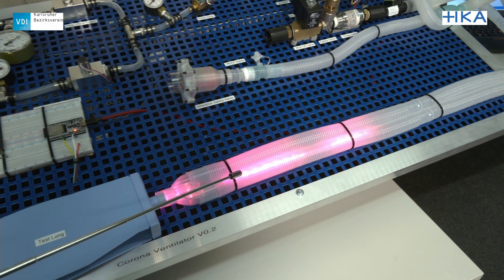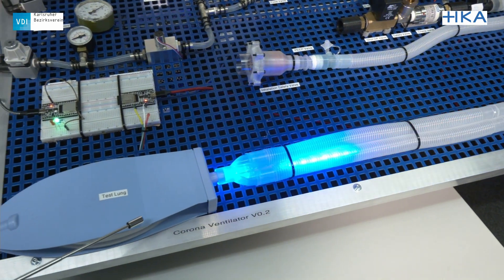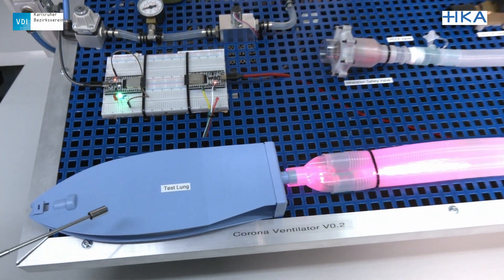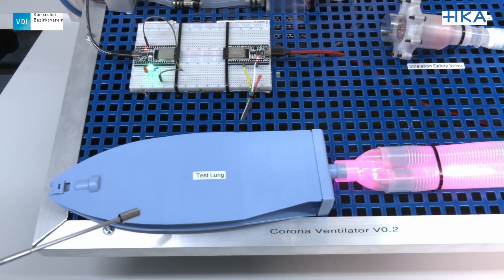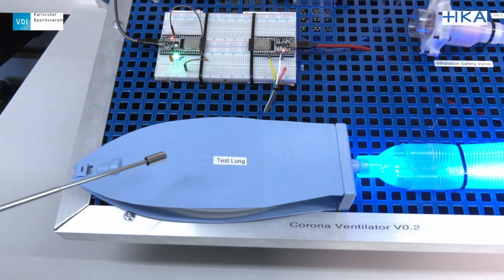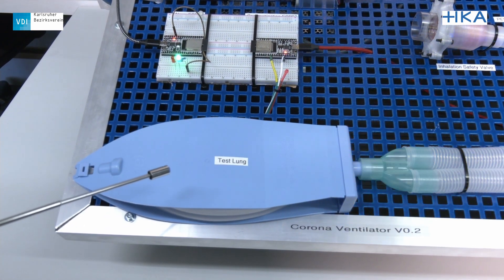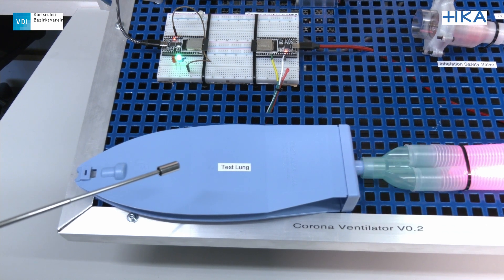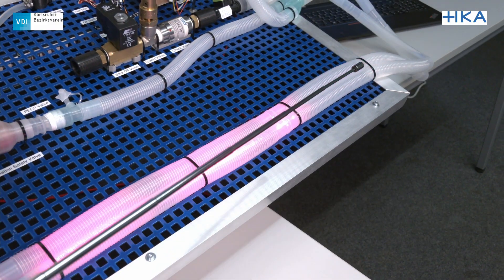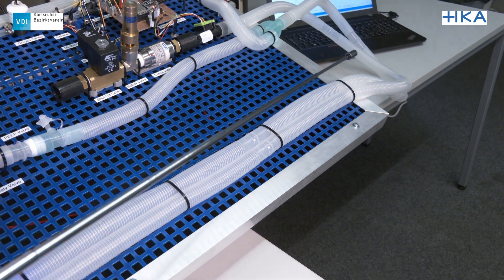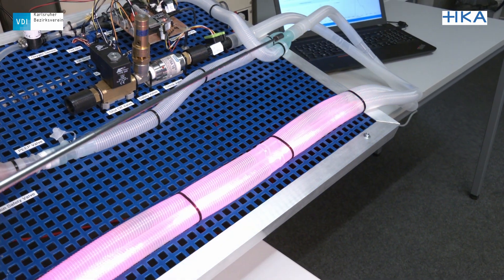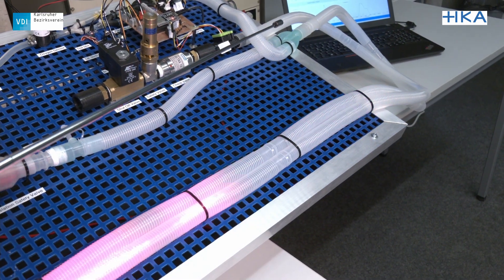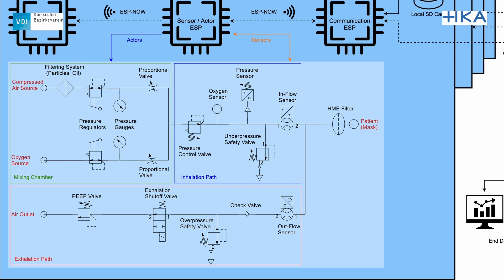The breathing air is then guided through the tubing package towards the lung. In our prototype, we use a test lung with one liter of dynamic volume and the compliance of an average adult. The exhaled air is passed through the second tube towards the exhaust valve, which opens fully on exhalation. The PEEP pressure is controlled by an ordinary PEEP valve and assisted by the pressure control loop.